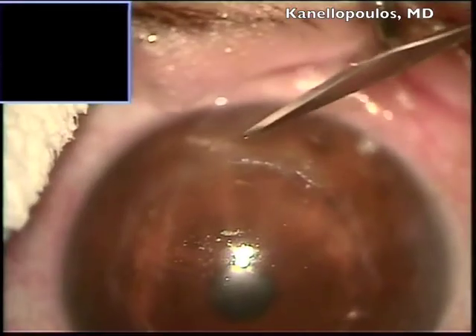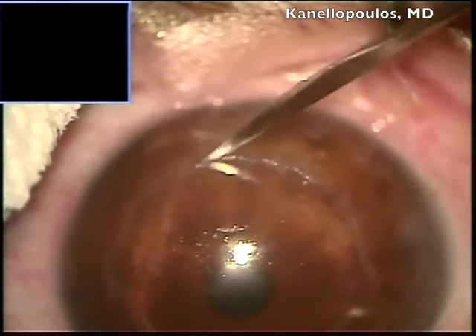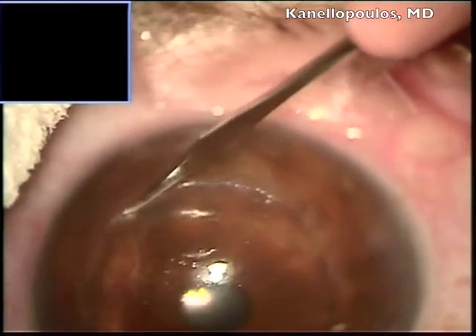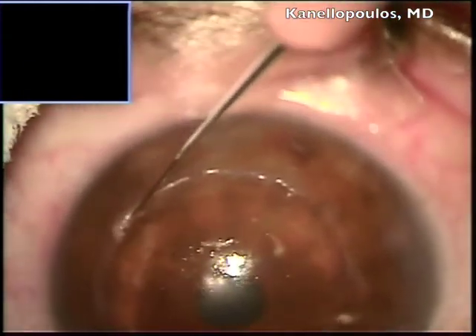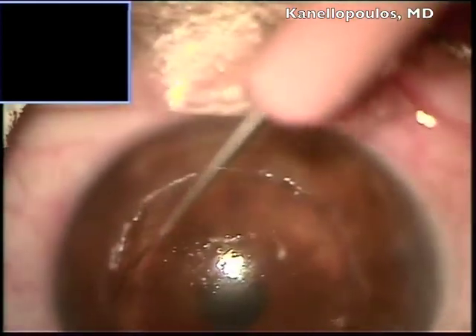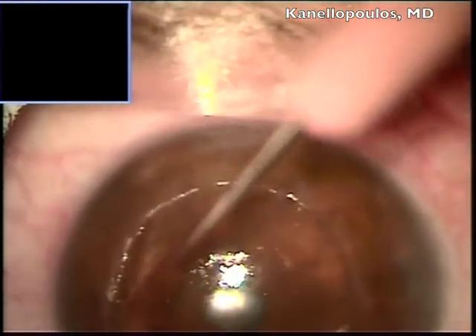It happens usually inferiorly, and it is from overt eye-rubbing that these patients never cease to do. So in the case of redoing the graft here, we opted to go back — you can see here a 15-degree blade — and manually reopen whatever is left from that graft-host interface. I'm quite careful. This is done under peribulbar anesthesia, that's why you see the patient poorly reactive, and obviously this is the surgeon's view, so everything is upside down.